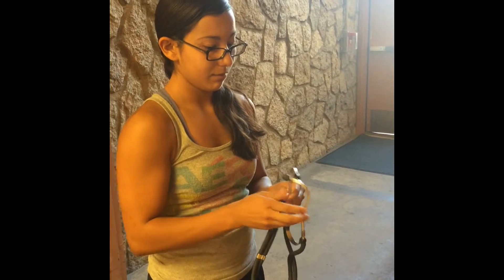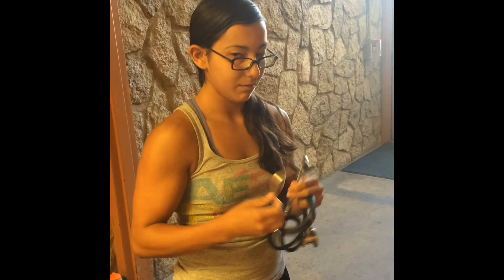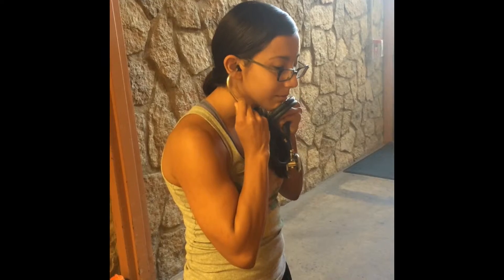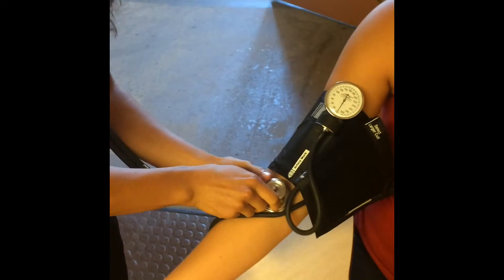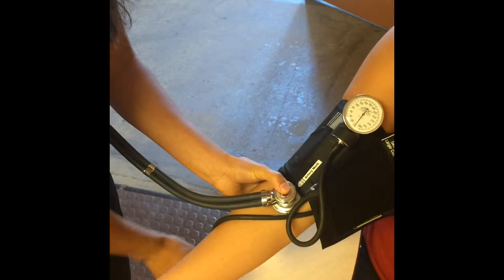Make sure that when you are putting the stethoscope on, the prongs are facing forward. That way you are able to hear the sound when the blood pressure is going through the vessel. Place the stethoscope chest piece below the antecubital space over the brachial artery. The bell and diaphragm side of the chest piece appear equally effective in assessing blood pressure.